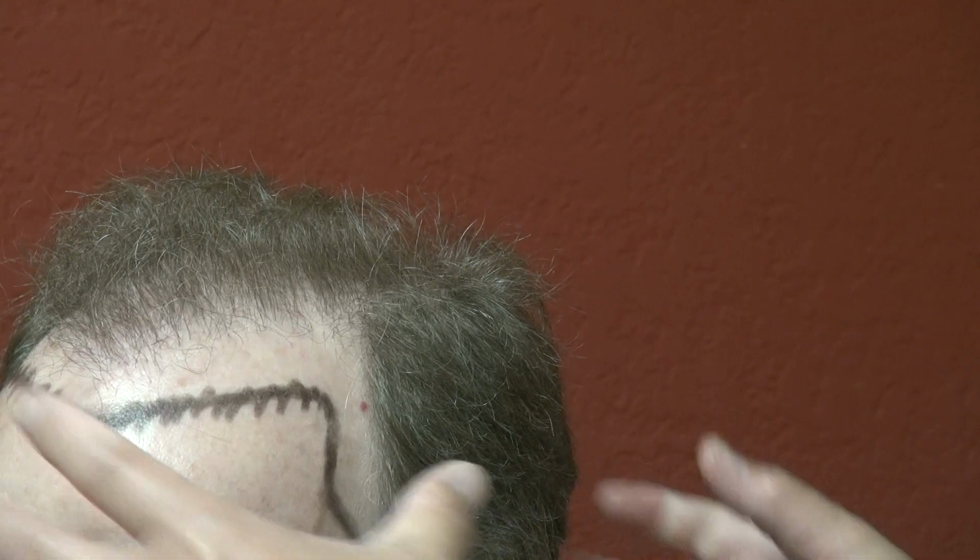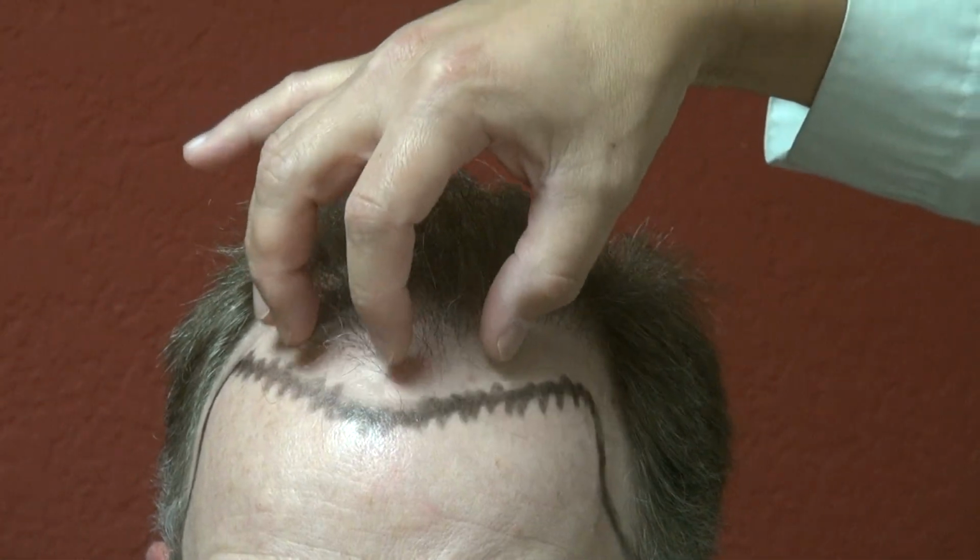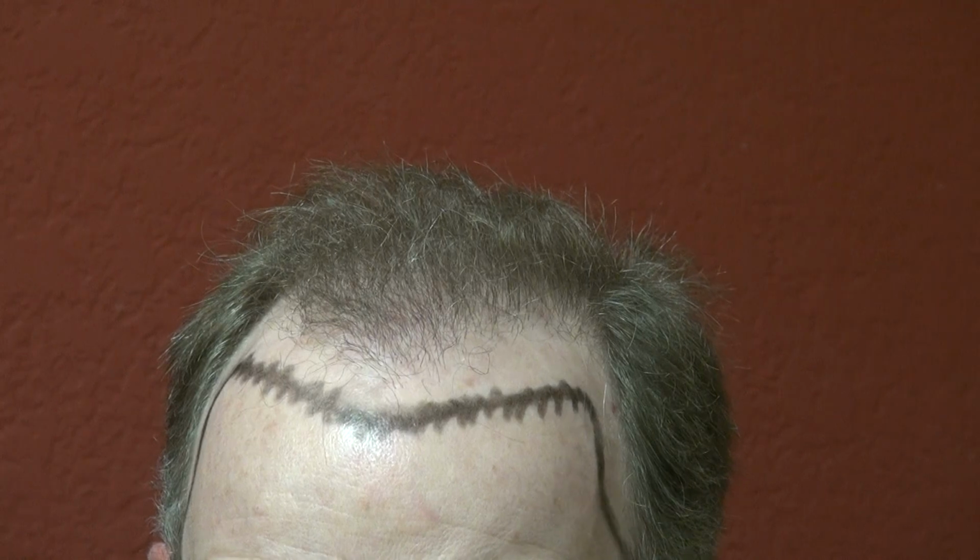The temple triangle is not designed for density, it's just for framing the face, and most of those hairs are soft, natural hair. In the front too, we transplant rows and rows of single hair grafts, followed by roots of 2 hair, 3 hair, and 4 hair in the back for bulk and volume.